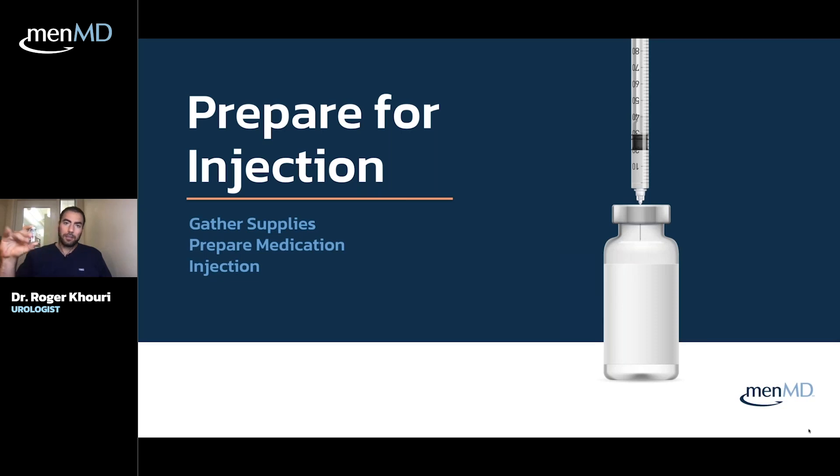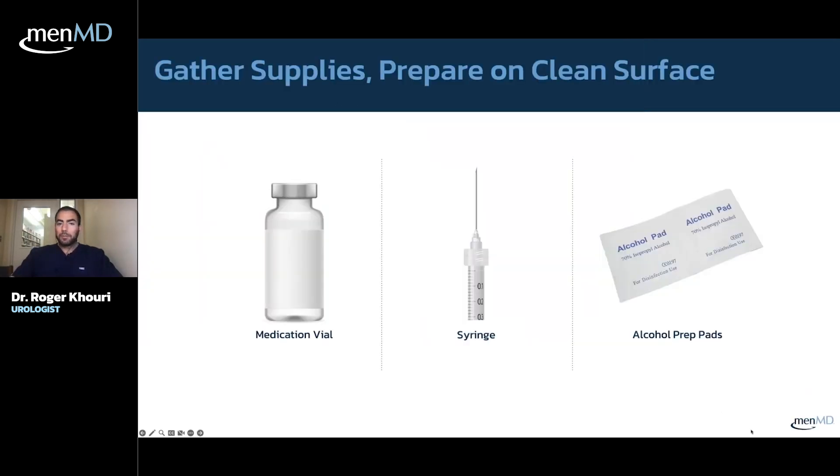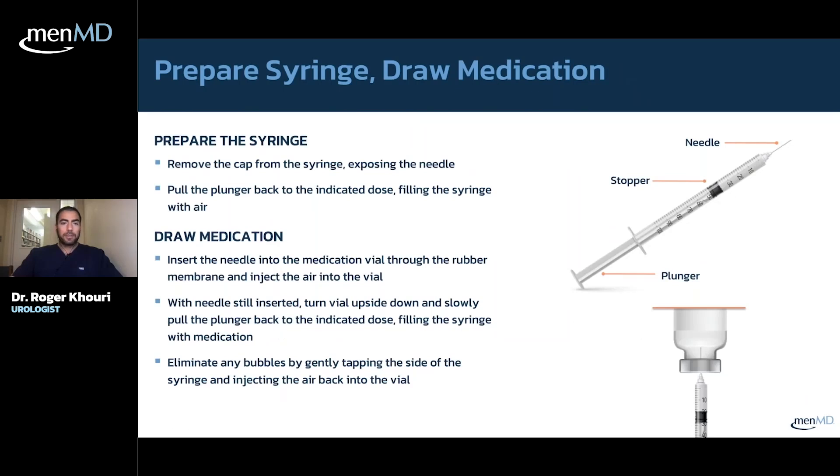The first thing you need is your drug — this is just a vial of water basically, but it's your medication that comes in these small cylinders. It typically comes in about 5 cc's. You need your syringe, which is just what it sounds like — something to draw the fluid, usually comes with a needle on top. The alcohol prep pads are just what they sound like, to keep the area clean.